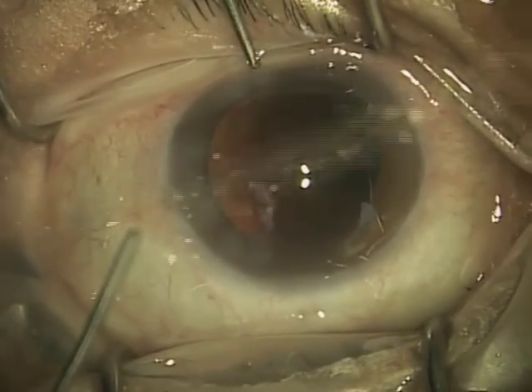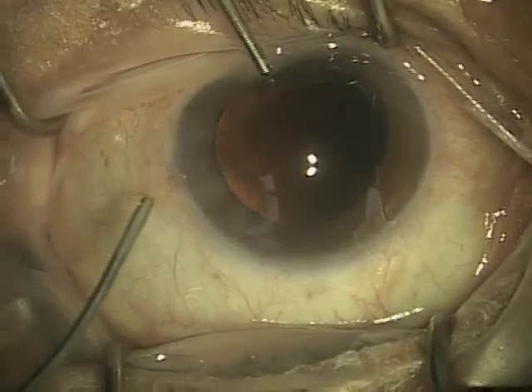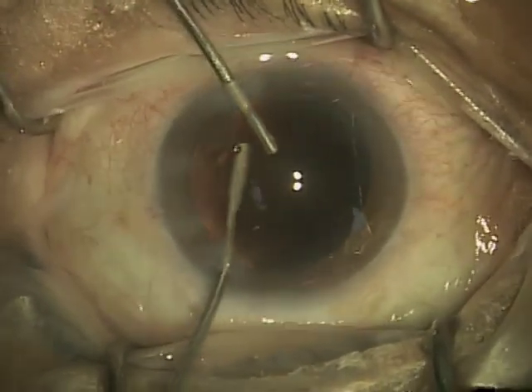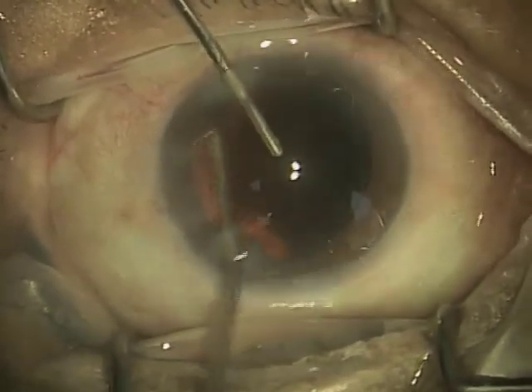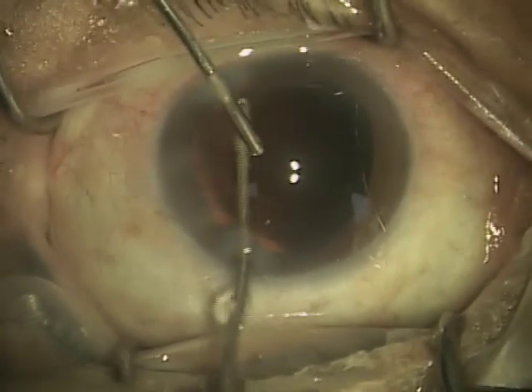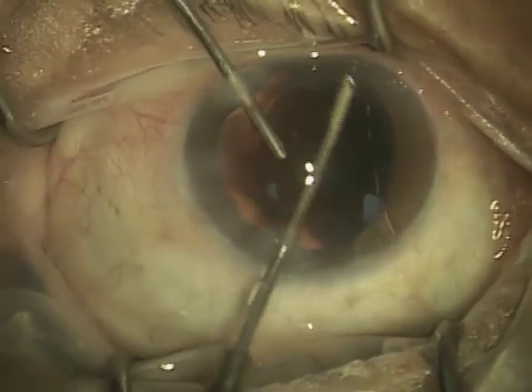Now the eye is ready for some additional viscoelastic. So I'm just going to have the patient look straight ahead at the light, and oftentimes as the view clears up, they start looking around. So I just informed the patient to continue to look straight ahead. In this case, there was a little bit more polishing that I wanted to do, so I'm going to go ahead and polish this.